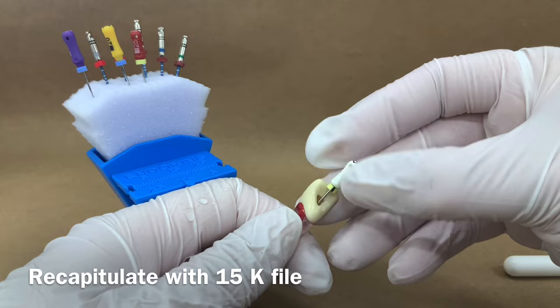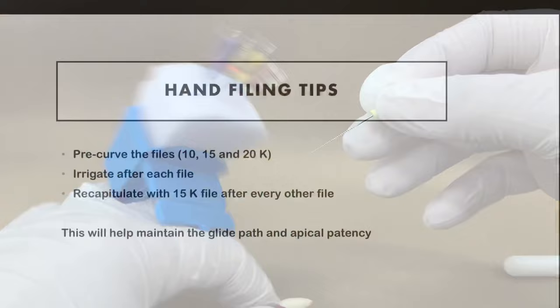Remember to recapitulate or go back in with the smaller 10 or 15K file to make sure you have apical patency or no blockages.